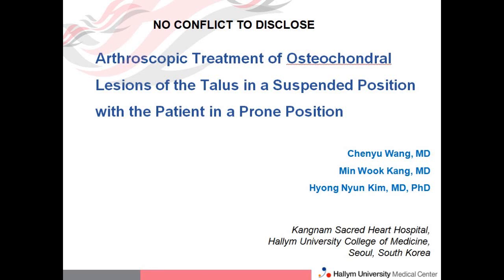In this short video, I would like to show the arthroscopic technique in a suspended position for osteochondral lesion of the talus.